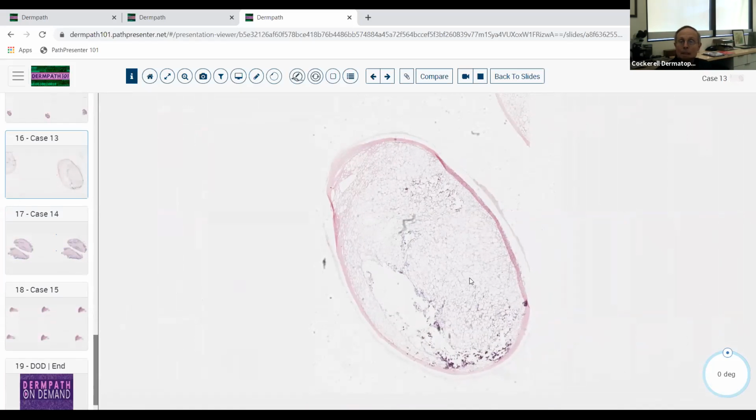Neoplasm. How was this taken? By an enucleation technique. So this probably was a little ball in the skin, and they probably said, well, this is probably a cyst, let's take a biopsy of this thing. They probably took a nick over it and out popped this lesion. And it's obviously very benign. Small, symmetrical, well circumscribed, we've got all those features.